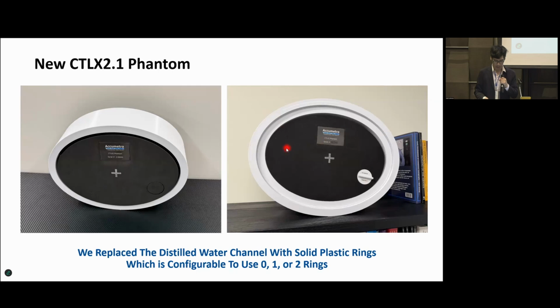So he's continuing to extend his phantoms to incorporate a lot more different things that can impact both the scanner and the measurement.